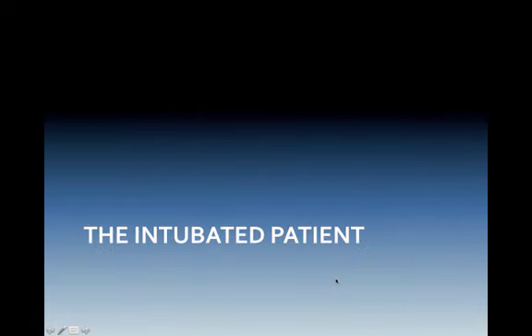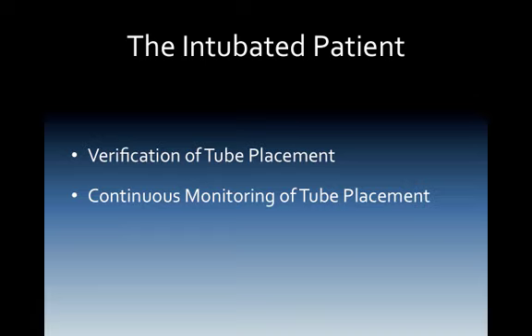Alright, the intubated patient. A couple things we get really quick off the intubated patient and monitoring an intubated patient with end-tidal CO2 is, number 1, verification of tube placement. If we get capnographic waveform, that tube is in the right location. And it also gives us a continuous monitoring of tube placement.